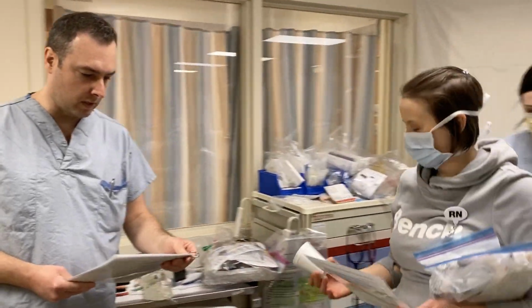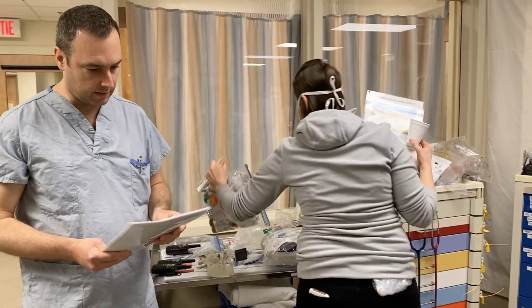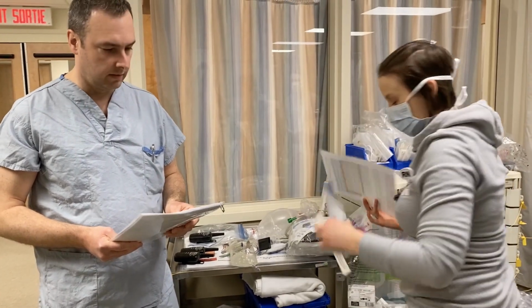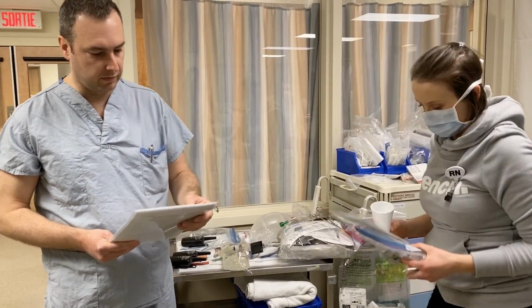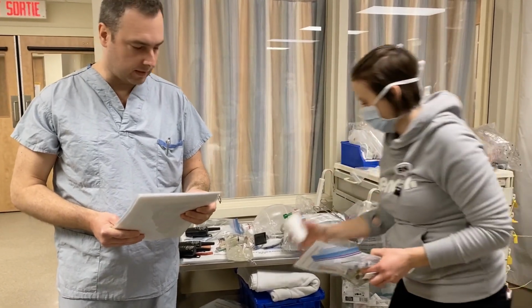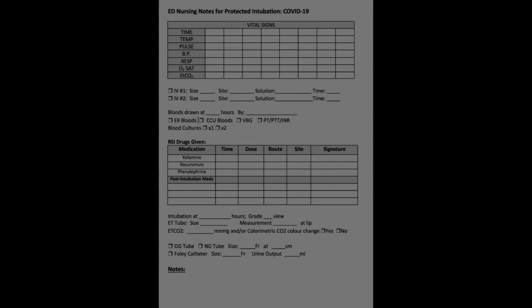So for inside the room, Jack, we have our IV bag pre-made. Yep. Here. Excellent. You're happy with your catheters? Yep. I've got those all in my hand. Cathlons. Yep. We have IV fluid and tubing. Yep. It's right there. And we have some ice if we take a venous gas. Yep. It's there. And something to document with.